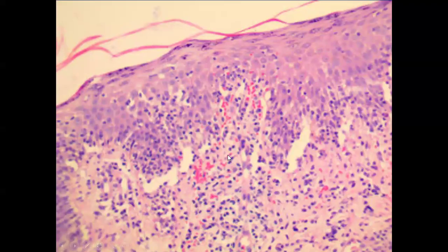The histopathological appearance of PLC is lens-shaped or focal parakeratosis and interface change. In PLEVA, you would see an interface change along with RBC extravasation and epidermal necrosis, which is not obvious in this histopathological appearance.